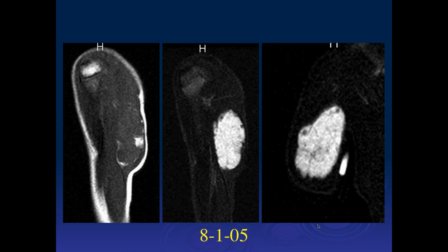Jeff, what do you think of this case? Okay. So August 1st, 2005. And this is possibly the wrist. I'm not sure. I think it's the shoulder. It's the arm, the upper arm, in a young child.